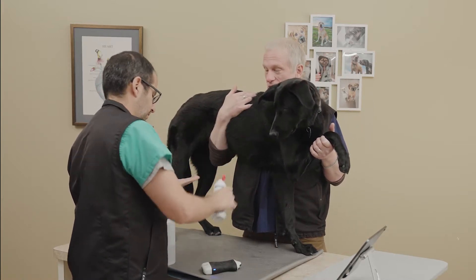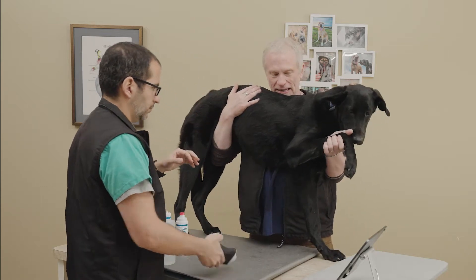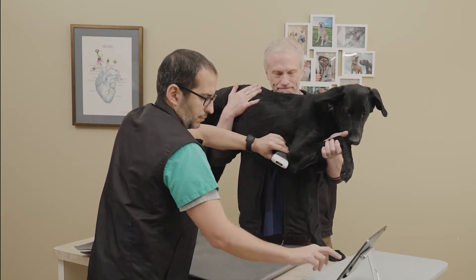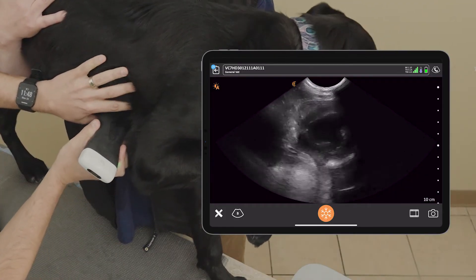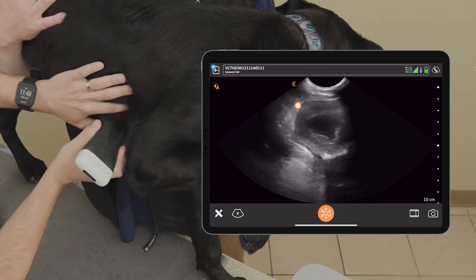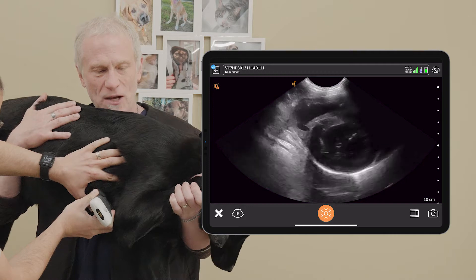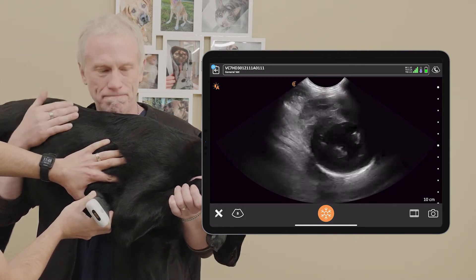Penny's interested in the gel. We're going to scan Penny in a standing position with the limb extended a little bit forward here. This right limb should open up a nice cardiac window to take a look at the heart. We're starting with our probe in short axis. The probe is down near the apex of the heart where the sternum is, and we have a couple of options — go dorsal within this rib space or jump a rib space cranial. We've jumped a rib space cranial and we can see we're now on that mitral valve, just at that level of the fish mouth.